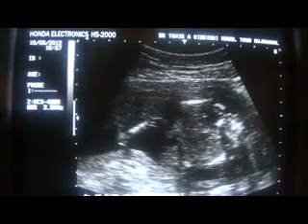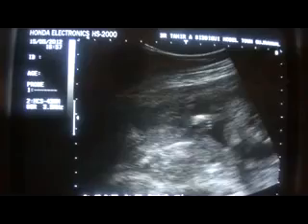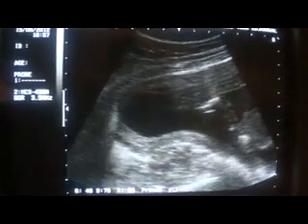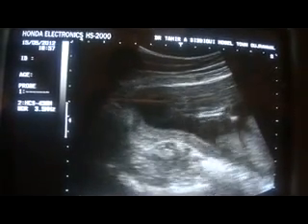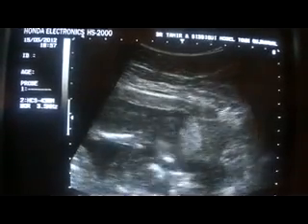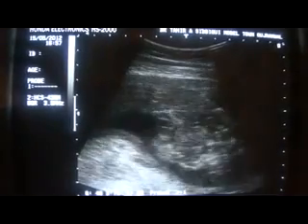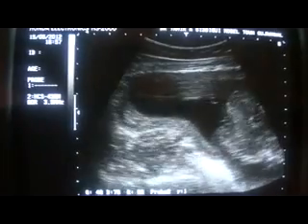And in transverse section you can see that there is an outpouching from the anterior abdominal wall. You can see it better. This is the transverse. I am trying to get the transverse of the fetus. The benefit of that is that any abdominal defect, anterior abdominal defect comes in view. And there you are seeing one.